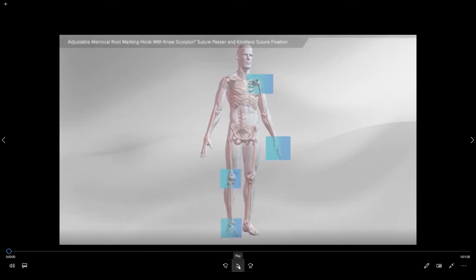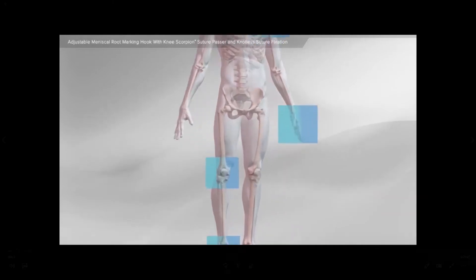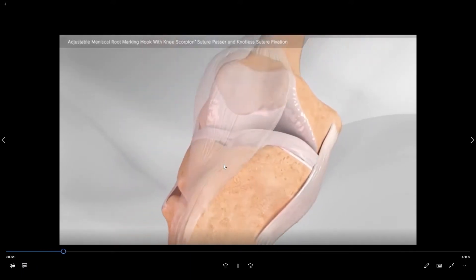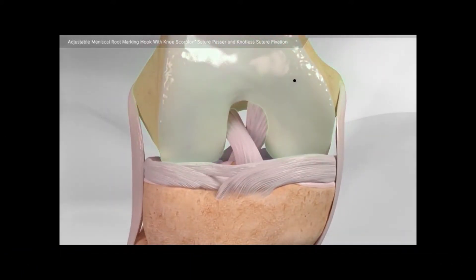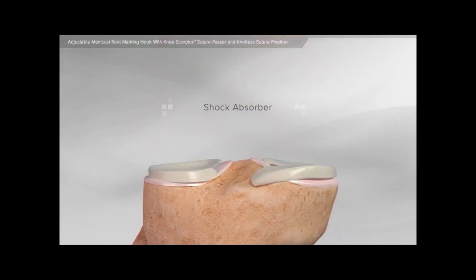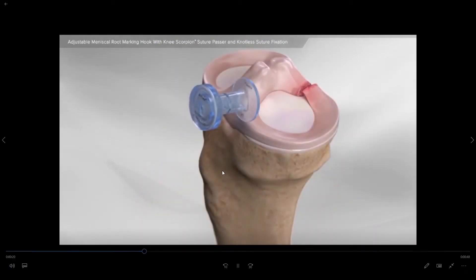For this demonstration we're going to look at the right knee. As we zoom in on the right knee we will see the femur up top, the tibia down below with the meniscus sandwiched between the two. The meniscus is both a shock absorber as well as providing stability to the joint.